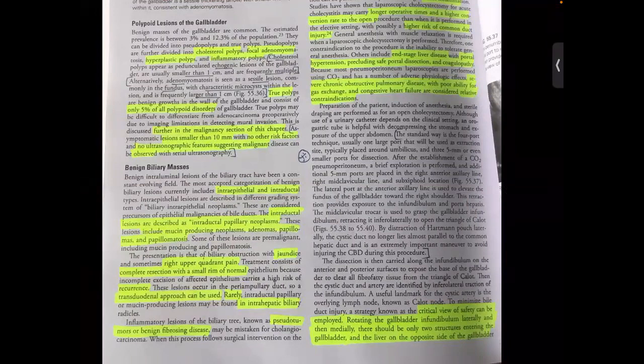After establishment of pneumoperitoneum with CO2, a brief exploration is performed, and additional 5 mm ports are placed in the right anterior axillary line, right midclavicular line, and subxiphoid location. The lateral port, that is in the anterior axillary line, is used to elevate the fundus of the gallbladder towards the right shoulder. So that is the first function of the lateral anterior axillary line port. This retraction provides exposure to the infundibulum and porta hepatis.